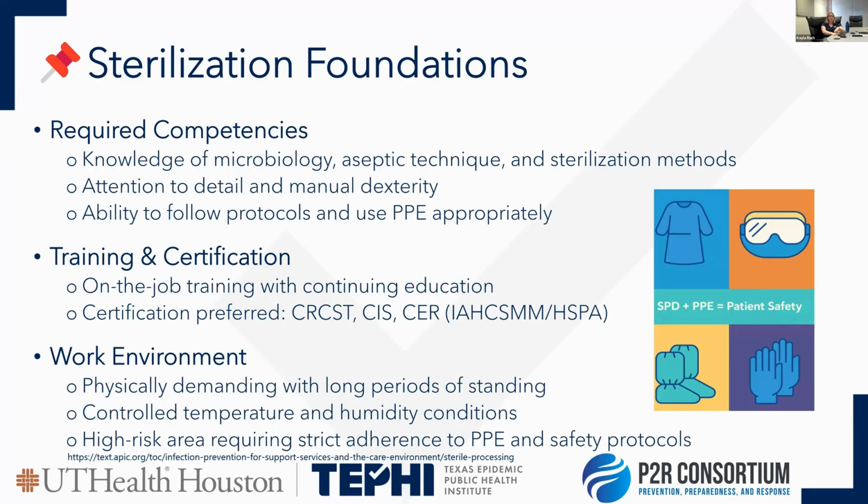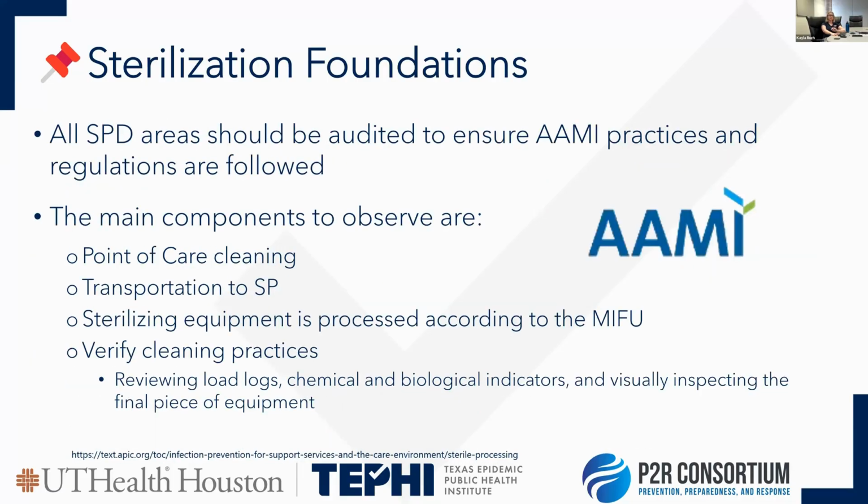Also, you want to make sure that they know what they're working with. They know the physical demand of this department. We're using good ergonomics so we don't have any back strain, knee pain, slips, trips, and falls in these areas. And then also because there's a potential risk of inhalation from different chemicals that we're using in the areas, that we know what N95 to wear, or if we're wearing a PAPR, how to don and doff PPE appropriately so that we're not contaminating ourselves and we're not contaminating the sterilized equipment as well.